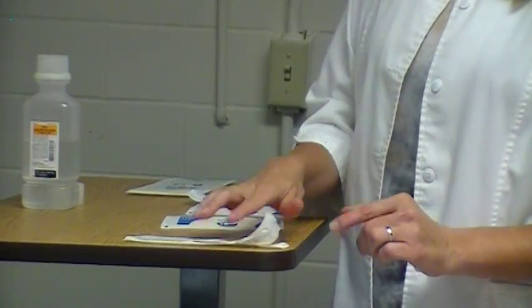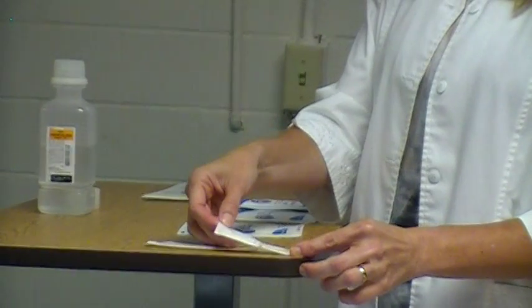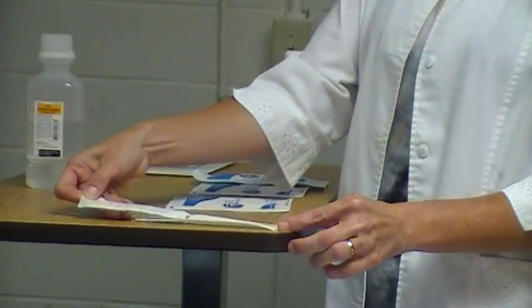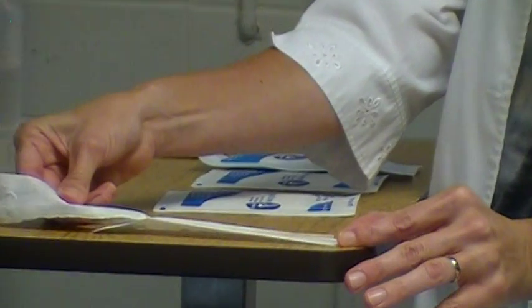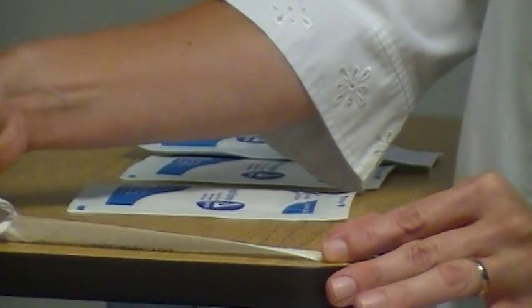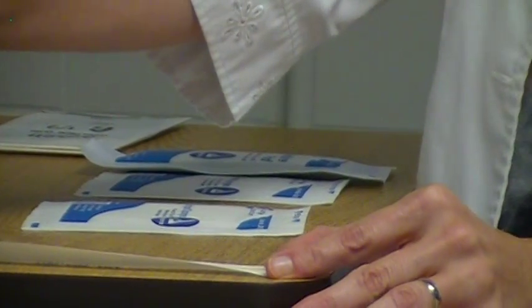Remember, I had already opened my Q-tip earlier a little bit, so I'm going to go ahead and open it the rest of the way. Be careful not to flick it out onto the table. That sometimes happens. Just make sure you pull gently, so that it's open where you can access it.